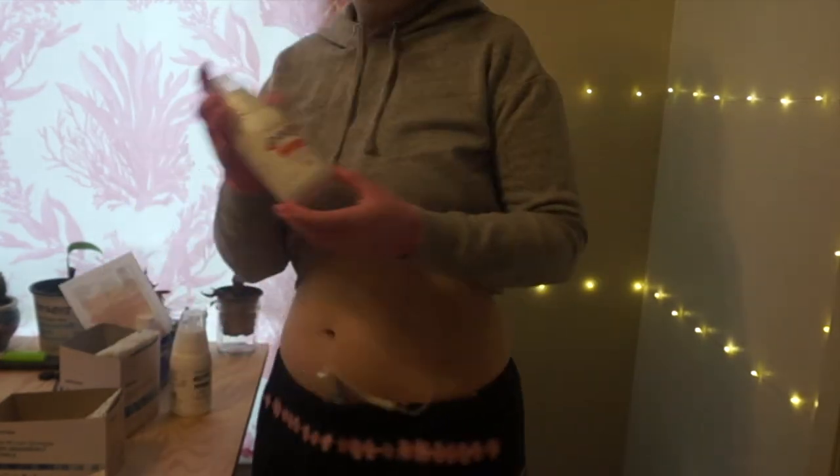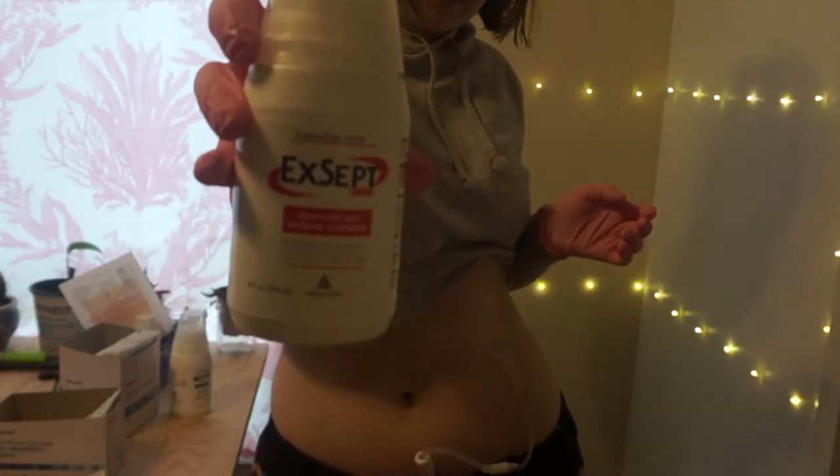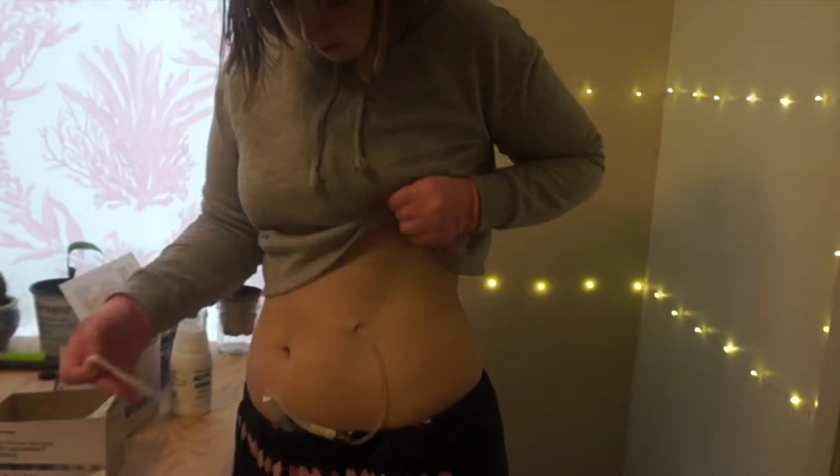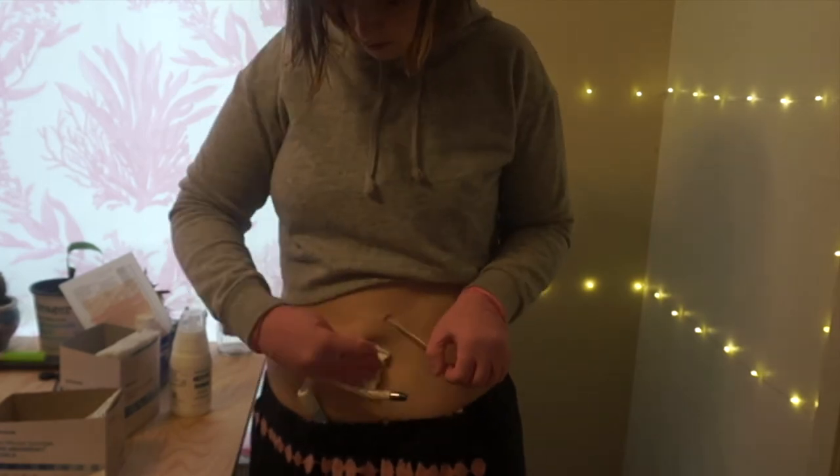Then I wiped down the skin with the adhesive remover on it, and I used the red label skin disinfectant and the blue label transfer set disinfectant on my catheter.